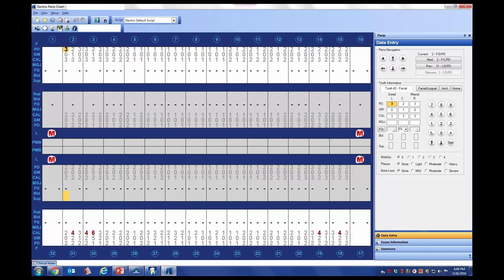Here what we're looking at is this patient's perioprobing results. Even though her tissues were very pink and healthy looking, you can see that she did have a couple of little problem areas where there's a six over here. Anywhere where there's red is an area of concern for the doctor to have a talk about cleanliness, brushing, and this could be indicative of occlusion or the bite, but also of an infection going on in the gums.